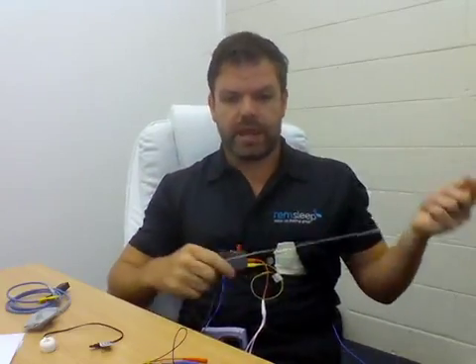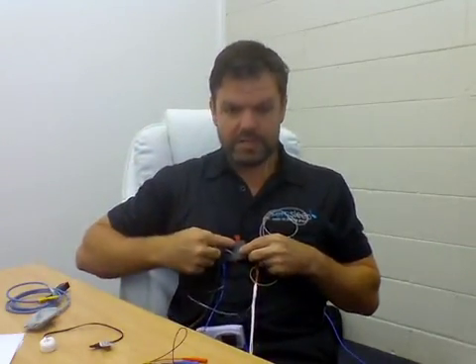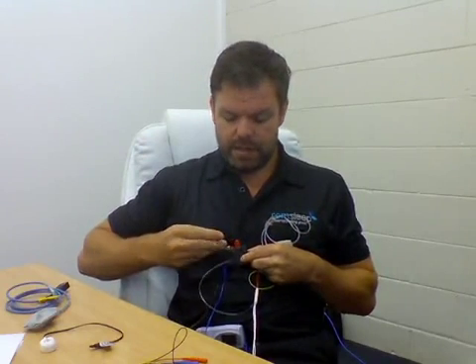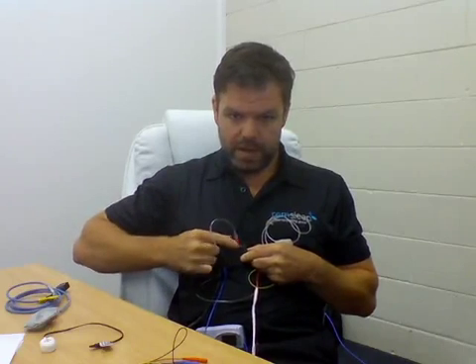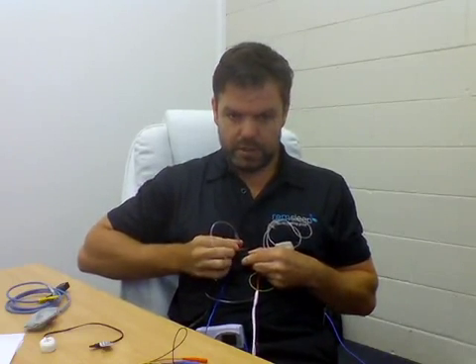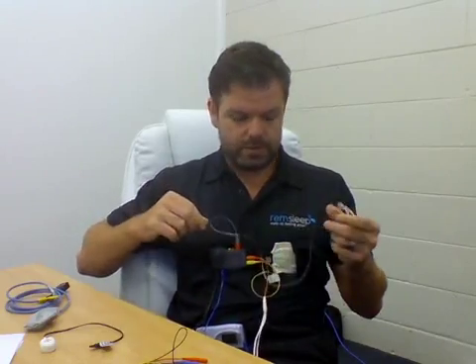It's important then to put some tape on your cheeks over the cannula just to hold it nice and steady, because when you move around at night time, it has a habit of shifting if it's not taped, and it's a very important signal for us. The other end has a little screw on it, where it says airflow, with this little red part here. You give it a screw, then twist the red part to lock it in, and then give it a bit of a pull just to see if it's locked, and it's locked in.